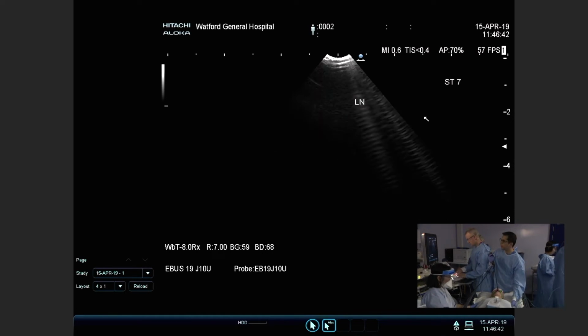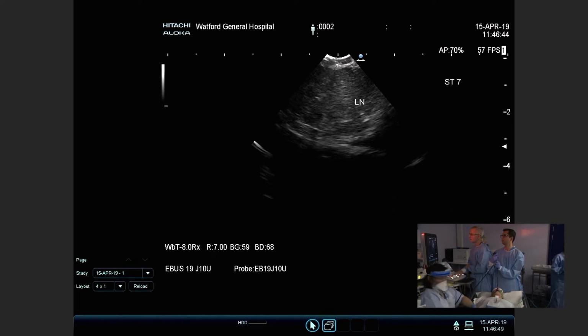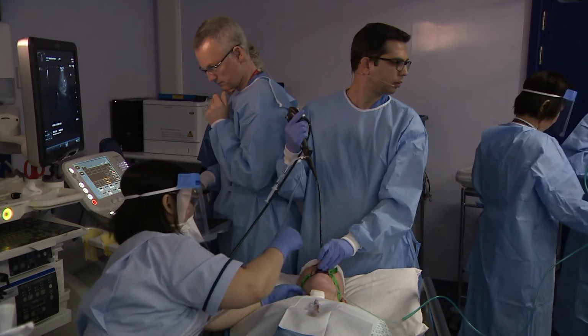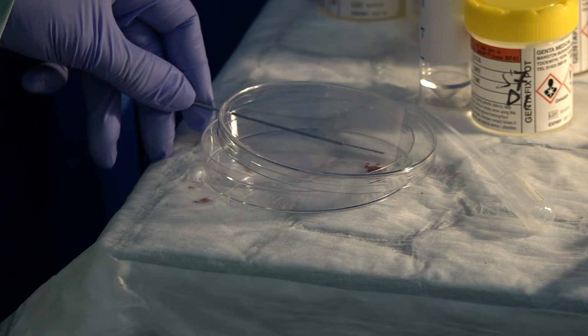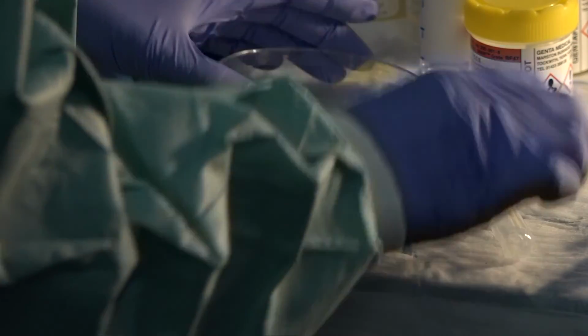Alright, sorry. We've taken the needle off, and that's making you cough. Okay. We're going to do a little bit of suctioning, or do we just record this for a second? Bear with us. This one? Better volume now. Okay, looks a bit better, and then we can carry on. Should we put a little bit of local down already? Oh, I'll leave them.